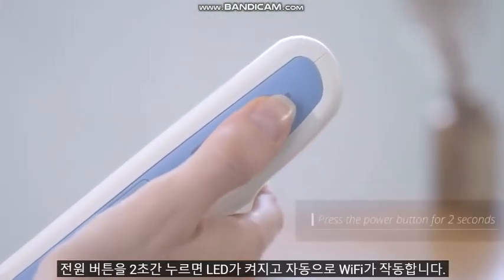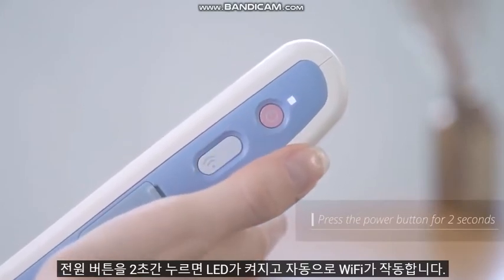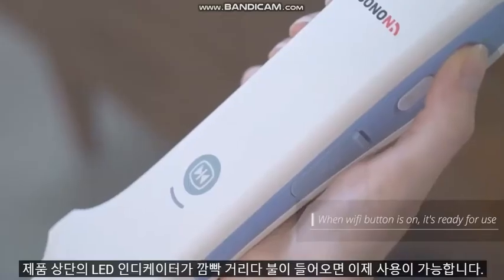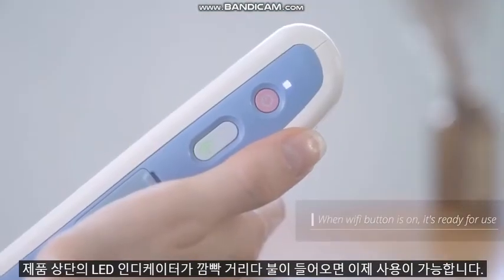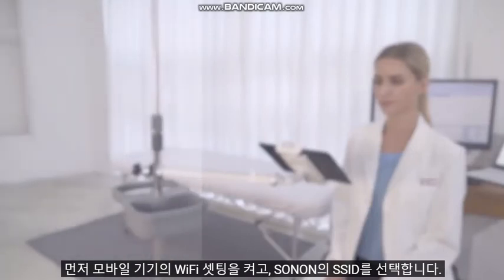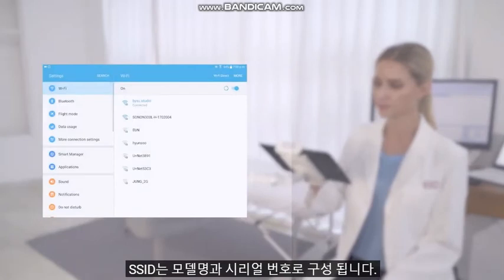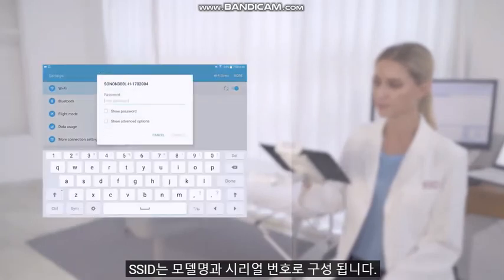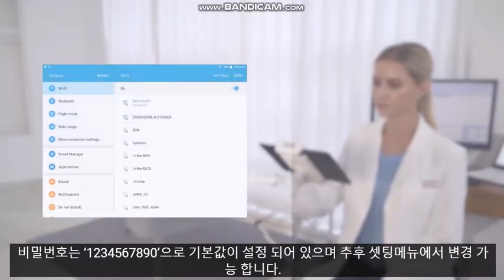Press and hold the power button for about 2 seconds to turn on the device and it will automatically activate Wi-Fi. The LED indicator on the top of the product is now blinking and is ready for use. First, go to the Wi-Fi settings on your mobile device and select the SSID. The SSID is named by the model name and serial number. The default password is 1234567890 and can be changed later in the settings menu.